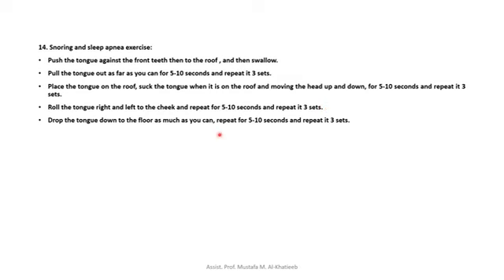Roll the tongue right and left to the cheek for 5 to 10 seconds and repeat 3 sets. And drop the tongue down to the floor as much as you can. Repeat for 5 to 10 seconds.